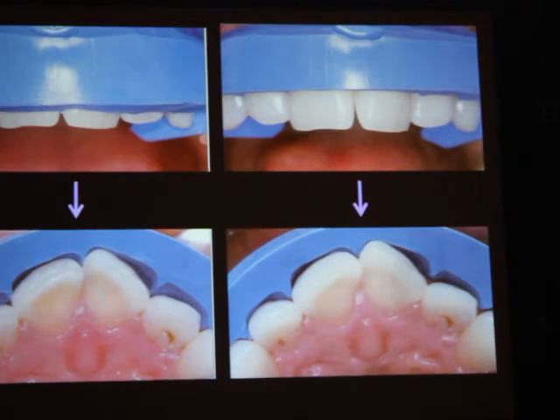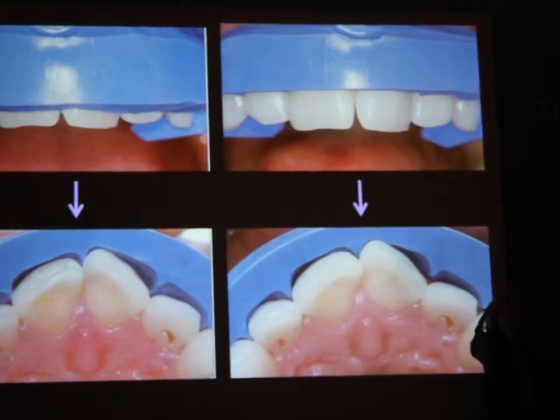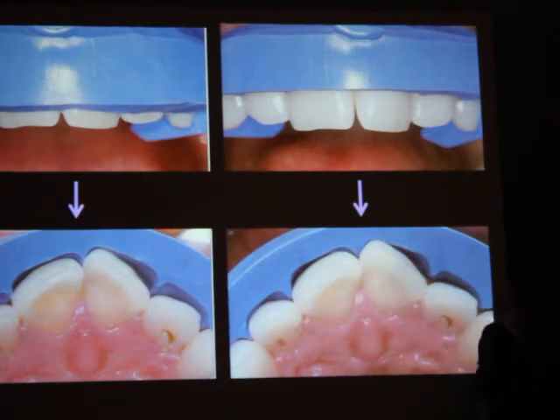So you see this tooth, thanks to my silicone key, I know that here I will not grind. I will just pass the burr to roughen the enamel, and that's all. At the opposite here, I will need to grind much more.